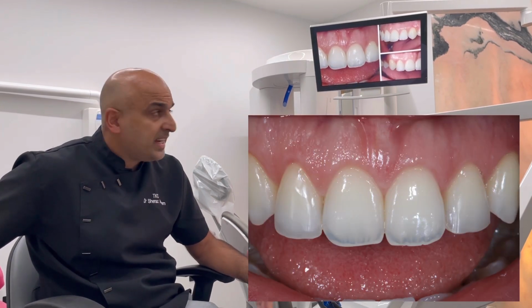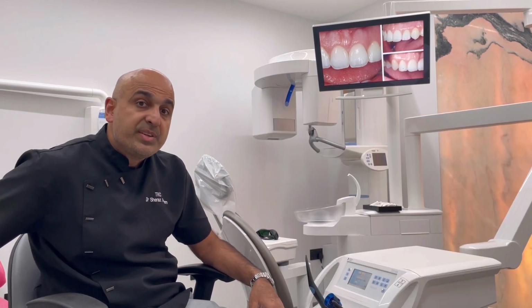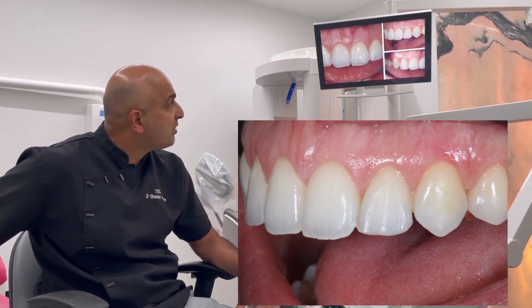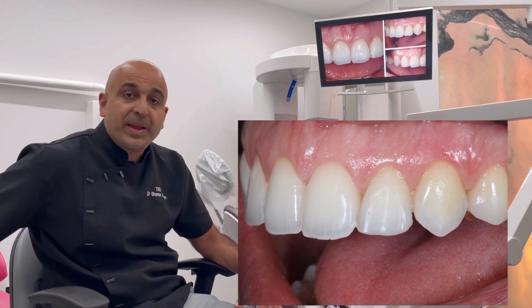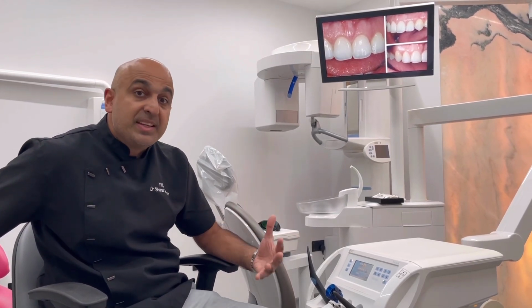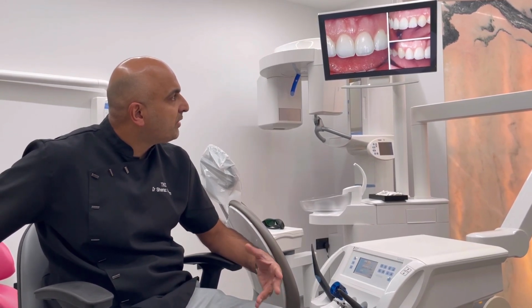You can see here the close-ups of the teeth. The composite bonding looks super natural, and it's literally all addition. We don't take anything off, we just add to the tooth, and it looks very natural. It's a nice way to show how we can get a correction in alignment and then build the teeth up to make them look more natural and match the other side. You can see lots of natural translucency here in the patient, which is so nice, and we were able to recreate that by using some very translucent composites, not ceramics. With ceramics, we're able to do the same thing, probably even better, just because ceramics reflect light even better than the composite resins. But nowadays, the composite resins are also good, so we still were able to create some nice translucency within this tooth.